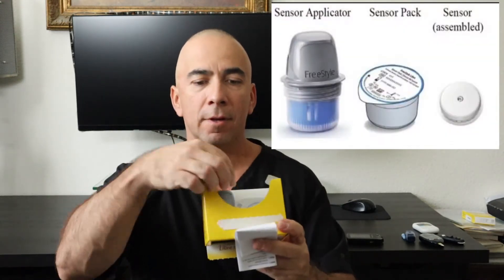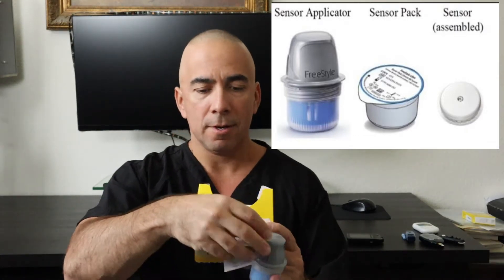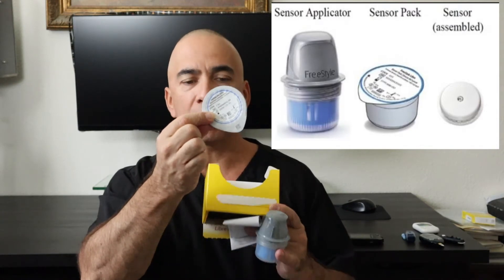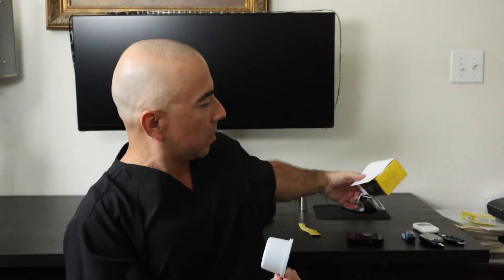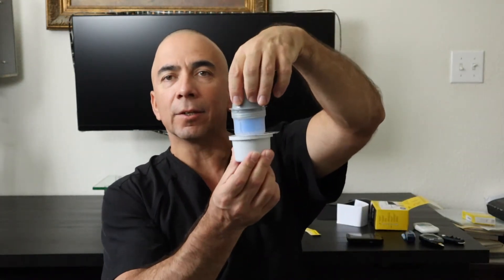In here in the box, we have the injector. And this is where our actual sensor is at. I'm going to show you how we put this all together — we're going to stick it into here, and inside of here is the sensor.